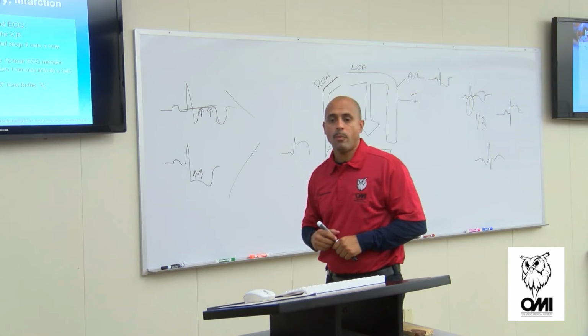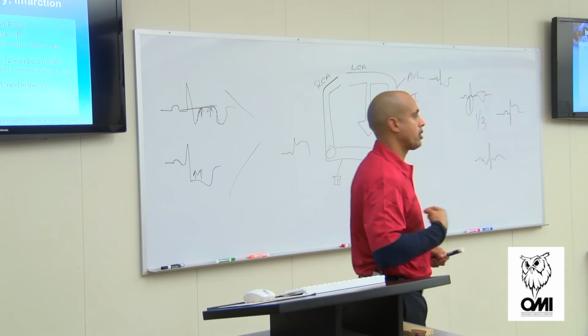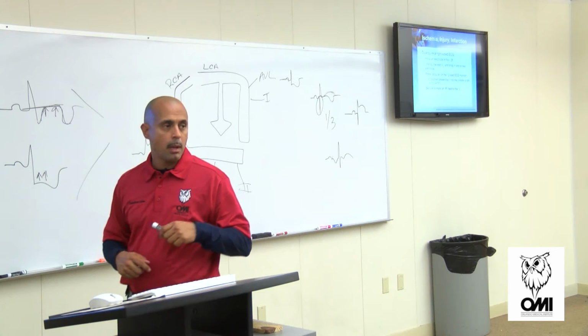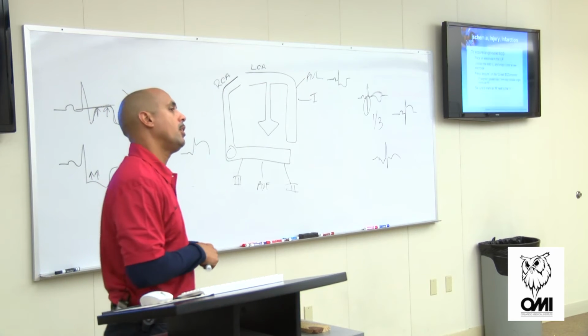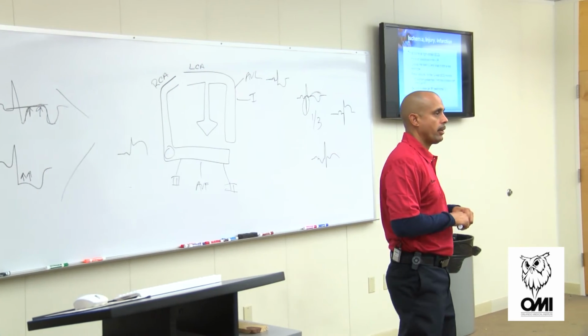When do we do a right side ECG? Who remembers? When we move V4 to the right side? When we have an inferior wall MI and the blood pressure is borderline low, okay? Because we want to see if the right ventricle is involved. If the right ventricle is involved, what could we do to get that pressure up? Fluid, very good.